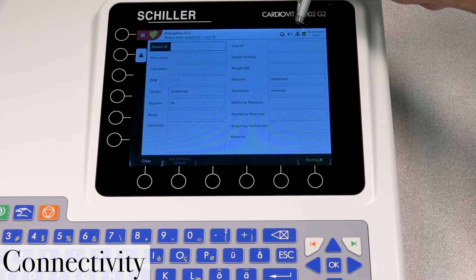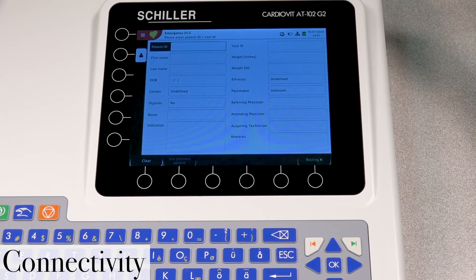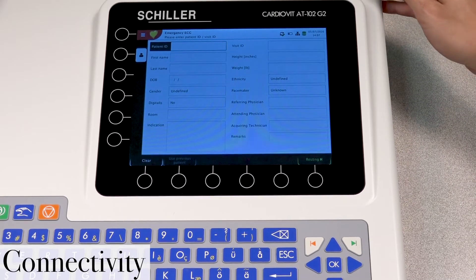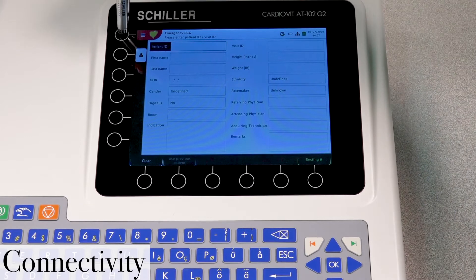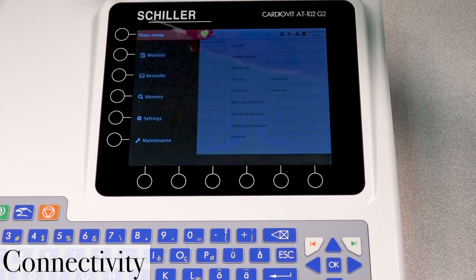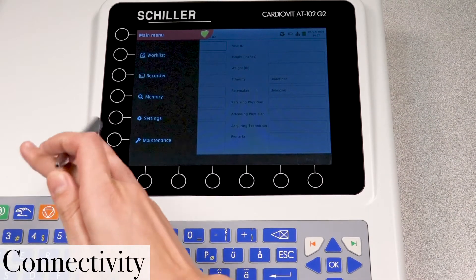So one of the first things that we want to do is check the connectivity settings that we have. We'll access that by pressing the main menu button over here, and then selecting the settings button.